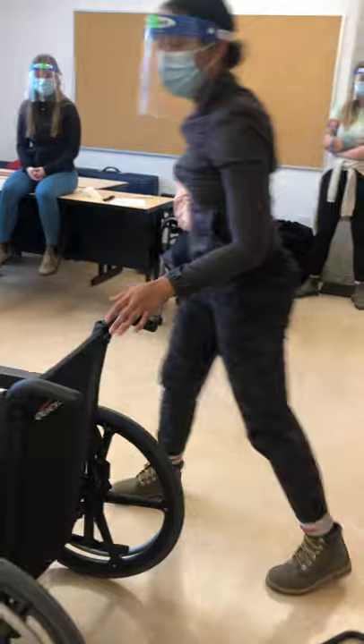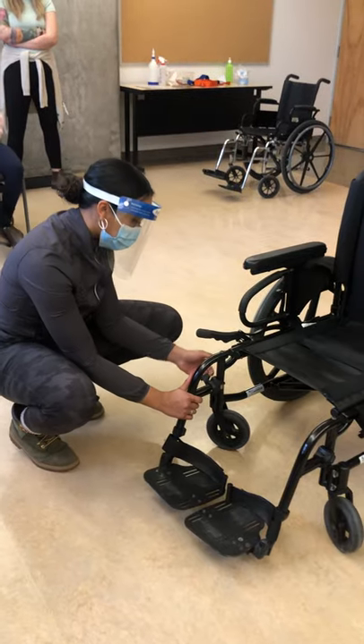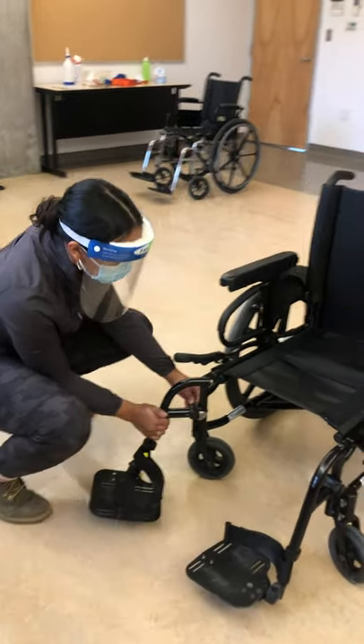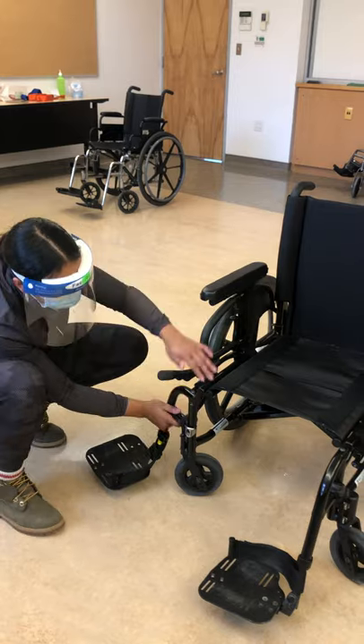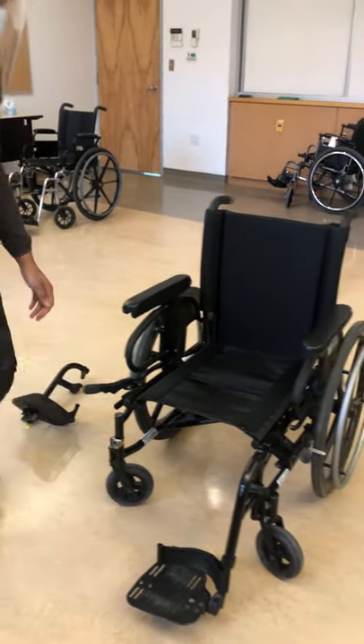Now I'm going to do the foot rest. There's a lever you push, and then you slide it towards you and then it pops off. I'll do this on the other side.